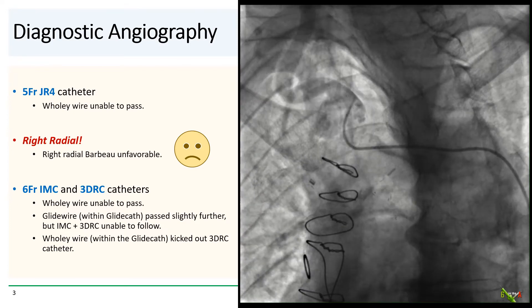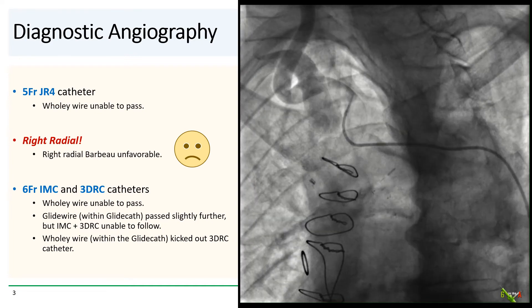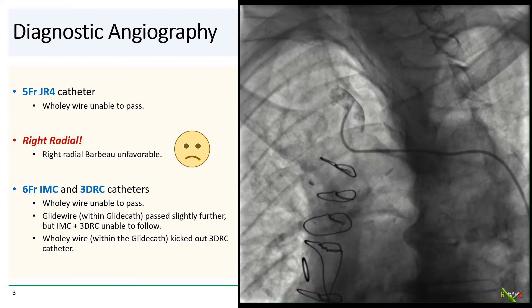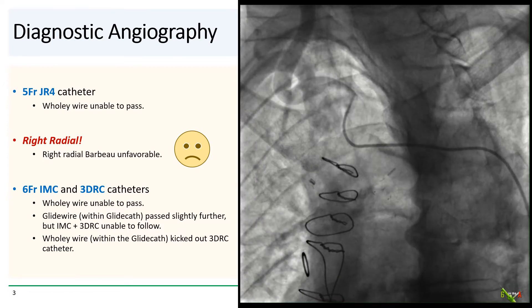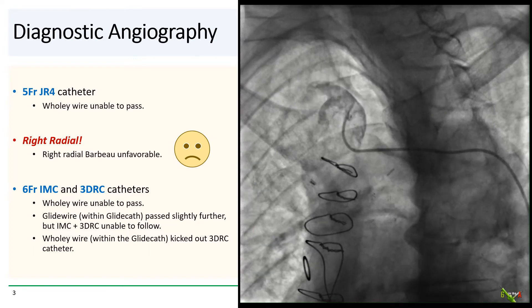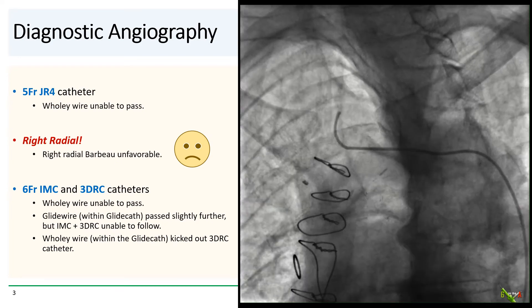We then decided to switch to right radial, but most unfortunately, the radial was bad. We then reached for the IMA catheter and then a 3DRC catheter. I have had a lot of good luck using 3DRCs for tough RIMAs, but in this case, the Wholey wire still could not make it down the subclavian.